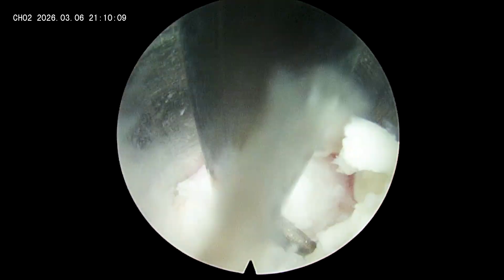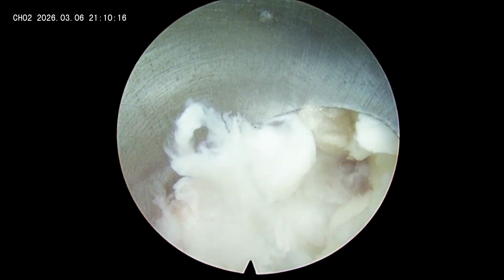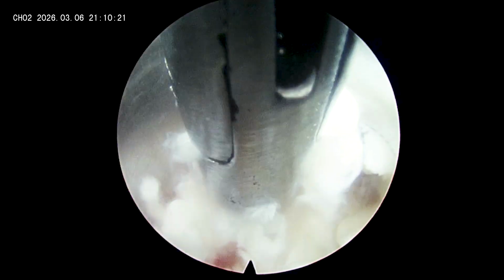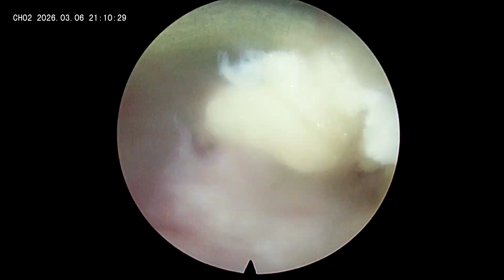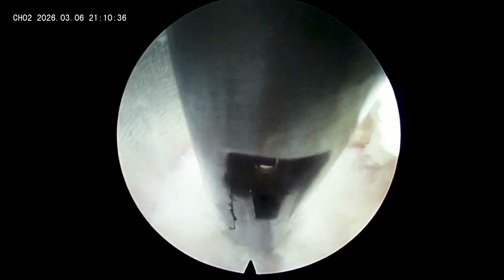Again, as I said, addressing the annular hump is very important here. What I'm doing is removing the lower part of the annulus near the lower end plate. As the fragment was caudally migrated, there are chances that there might be a fragment caudally below the root. That's why I removed more of the flavum from the lateral recess caudally. So yes, there is a fragment.